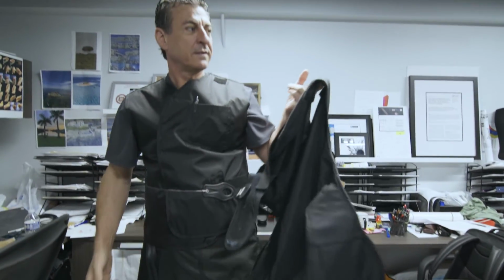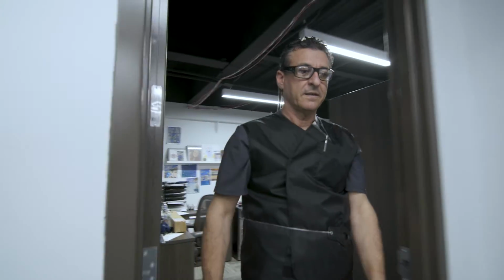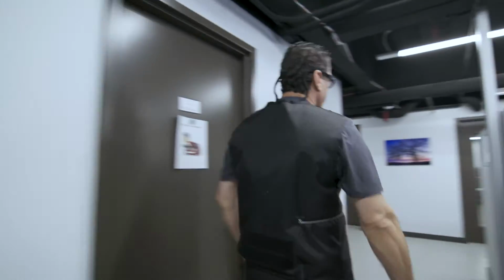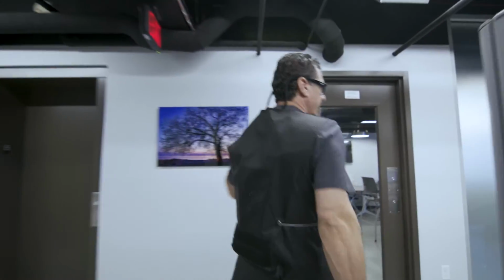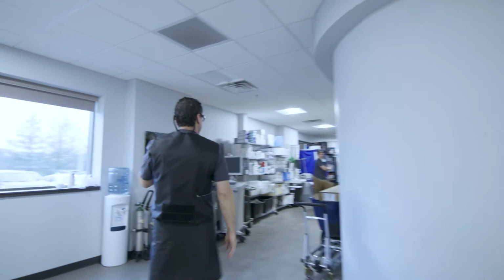And you'll be so surprised how much great radiation protection technology is available for us. We have not looked for it because we physicians are almost tunnel-vision people. We get up in the morning, come in, do really complex surgeries, and don't think about ourselves. But I did the opposite for almost 6 months, where I did research until I found material that is thinner than the current material that we have, and lighter. When you think of the physics and how you can distribute the weight of any lead, especially when you lower the weight of it, you can protect your body with a lot less lead, but also with the dynamic of the way you make the lead.